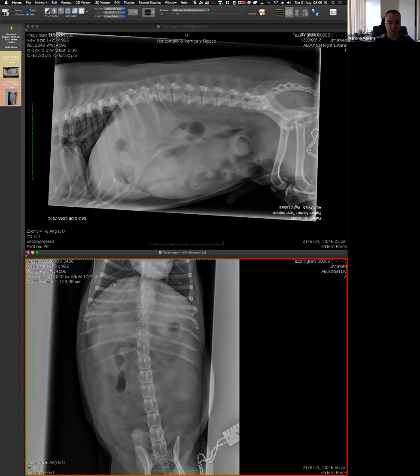And we do the same thing. Take a look, and then I take notes of all your findings. We see if we all agree on them or not. And then we see what we recommend and how we interpret the abnormalities, if there is any.